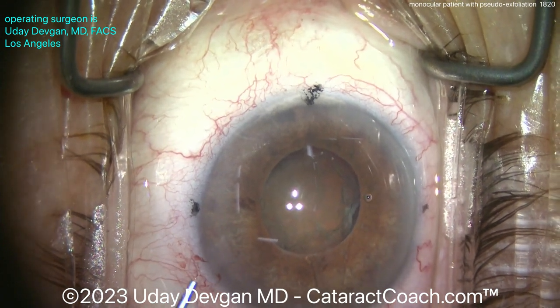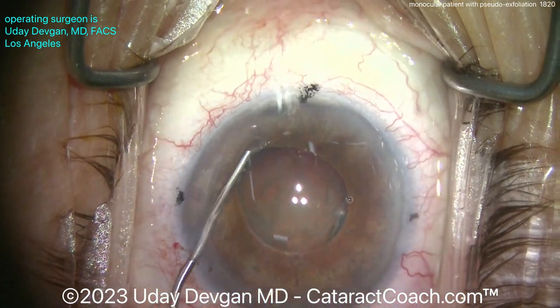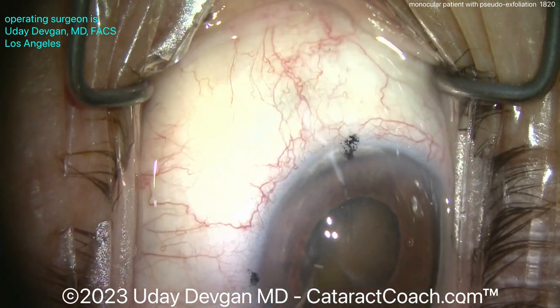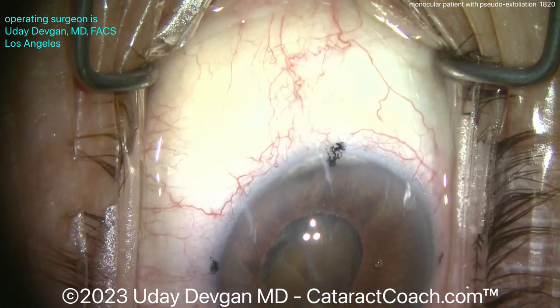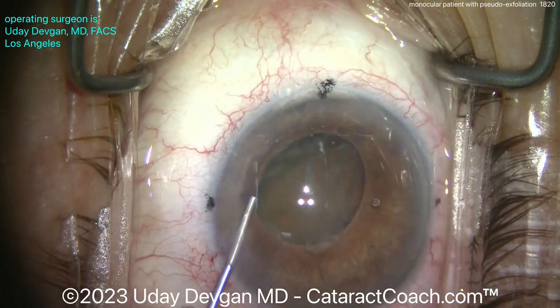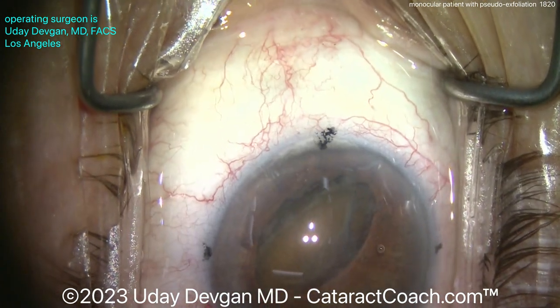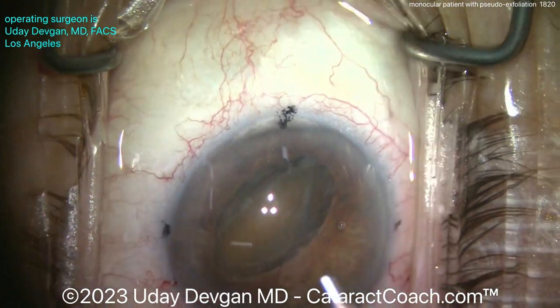More dispersive viscoelastic going in here, and I'm going to use the cannula to help lift and dial the nucleus up out of the capsular bag — here it goes, dialing it up nice and easy. Dialing it up even more through the main incision, and now recoating the endothelium as well with an additional aliquot of dispersive viscoelastic. The nucleus is being held in place and now I can put the phaco probe in.